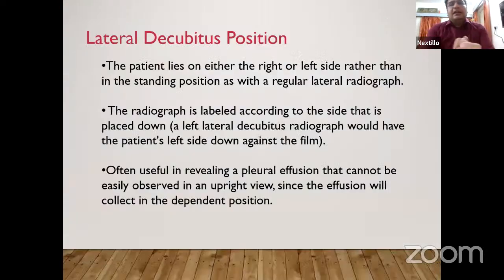Okay, now the lateral decubitus position. As the name suggests, in lateral decubitus the patient is placed lying down. Where is the use of this lateral decubitus position? It is actually useful in revealing pleural effusion that cannot be easily visualized in an upright view, because the lateral decubitus position is one of the best X-rays to look for pleural effusion.